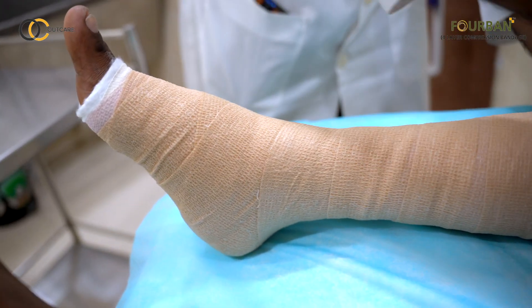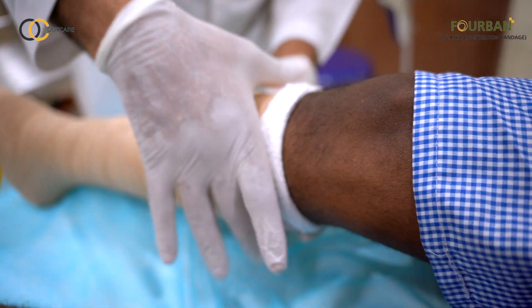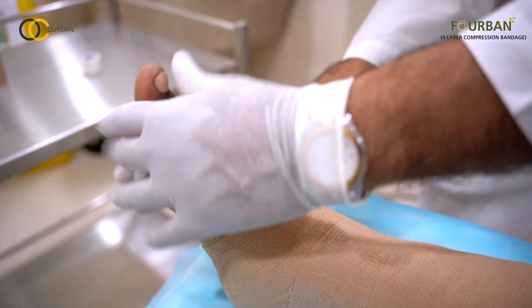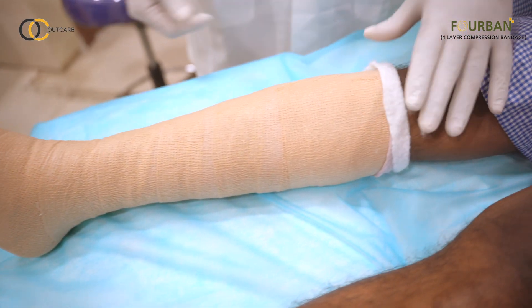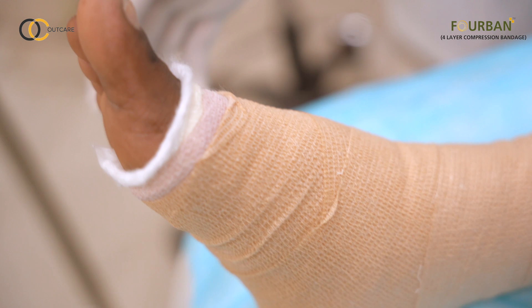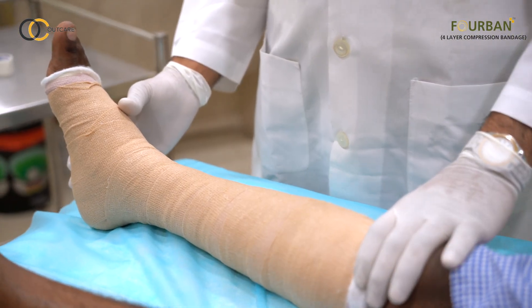This is how it should look at the end, with the first layer of the 4-layer bandage rolled down a little bit so as to avoid any injury to the skin from the tight compression bandages. This bandage can be maintained for around 4–7 days and changed after that. One more important thing: the ankle-brachial index should always be more than 0.8 in such patients. If it is less than 0.8, this application is contraindicated.